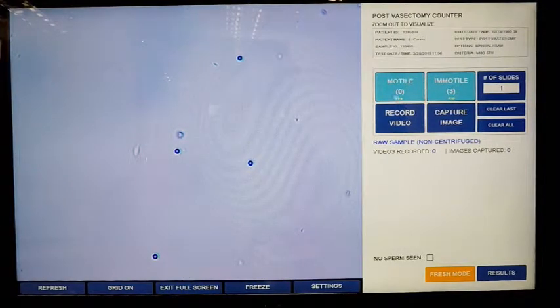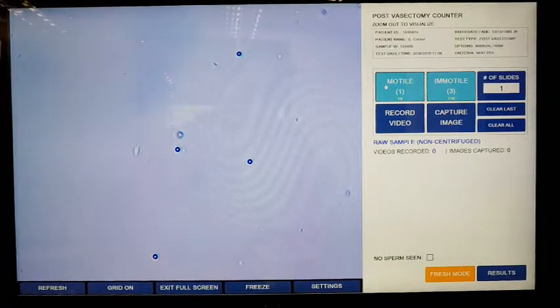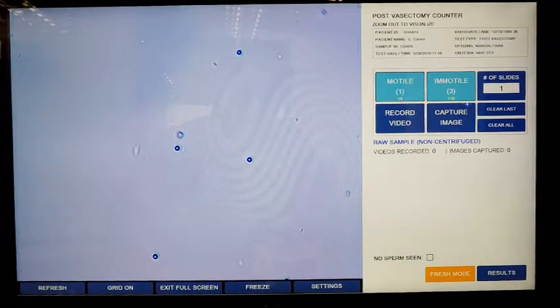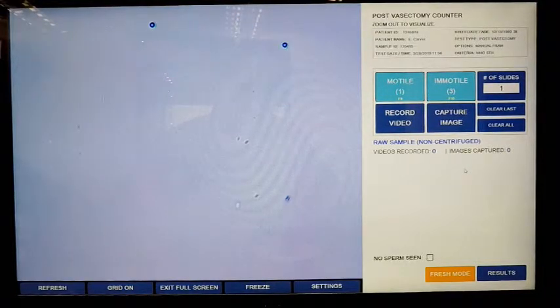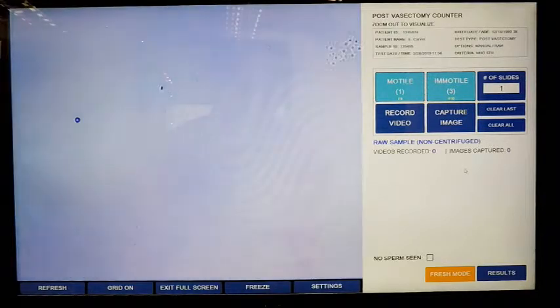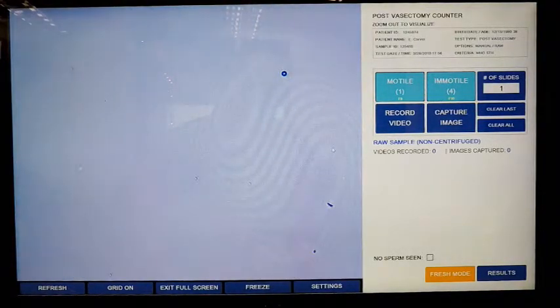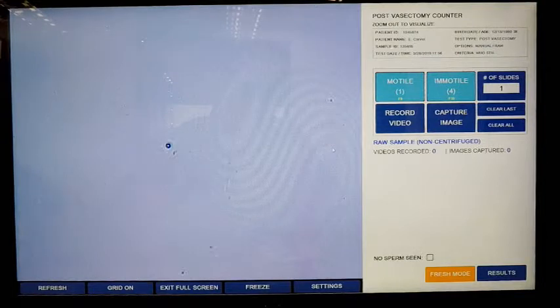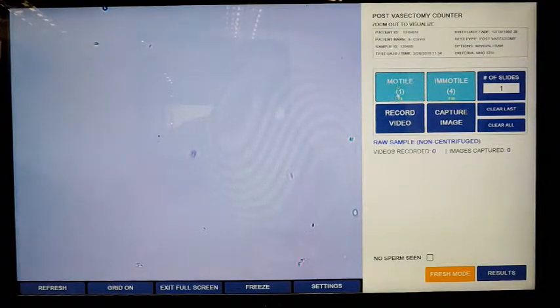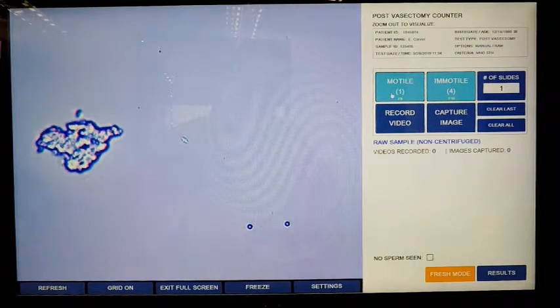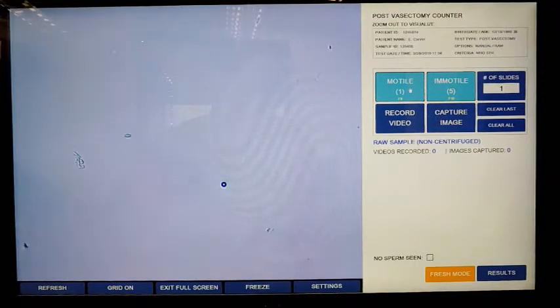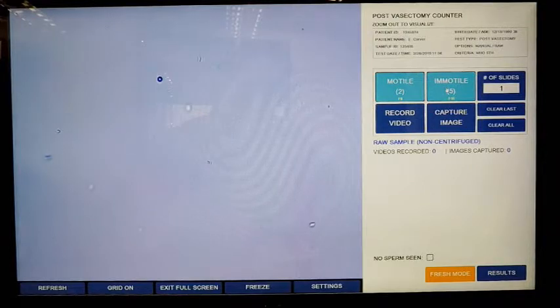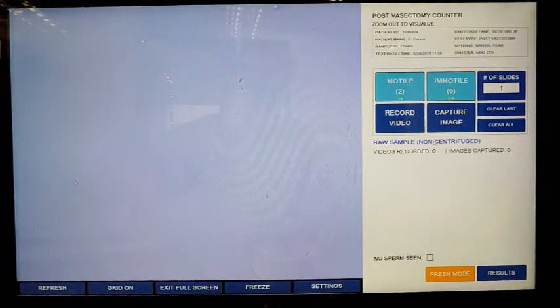I'm not doing this 100% accurate, but you can understand the concept. Let's say one of these was motile, I'd just say motile here. You can also use the F9 and F10 keys as shortcuts if you want. I'll keep scanning through, you can see it's pretty clear. Here's another one, we saw an immotile. This is just an example. When you see real sperm, you can easily recognize if they're motile or immotile. So from here, I'm going to hit my results.